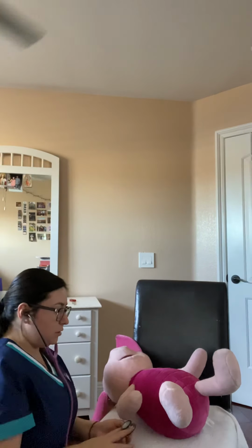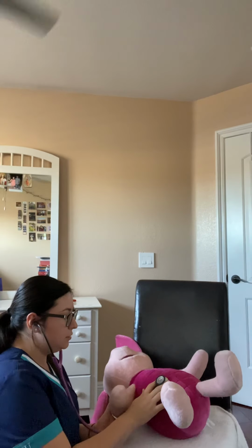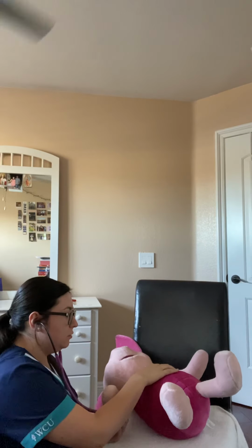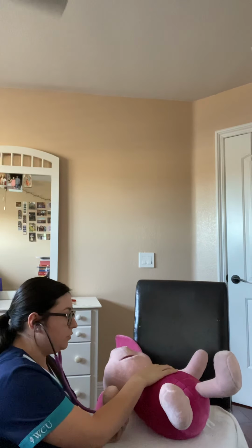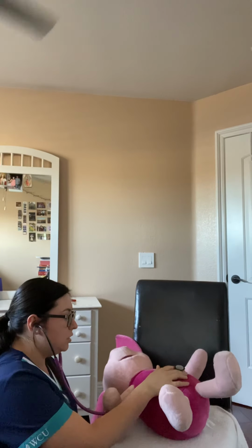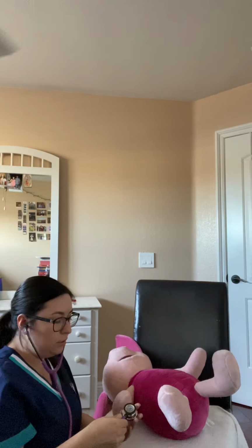I'm going to start on the right lower quadrant for 15 seconds, right upper quadrant for 15 seconds, left upper quadrant for 15 seconds, left lower quadrant for 15 seconds. So I did hear about 15 to 20 gargles per minute.